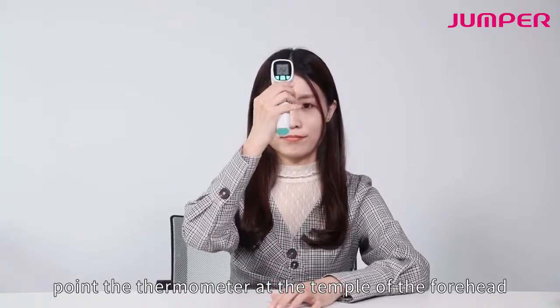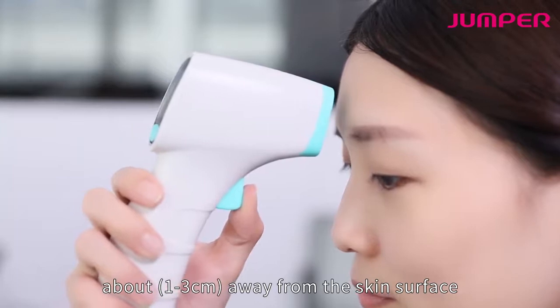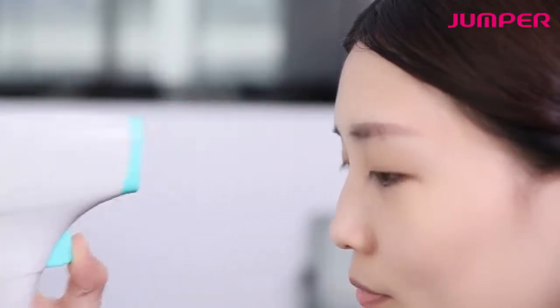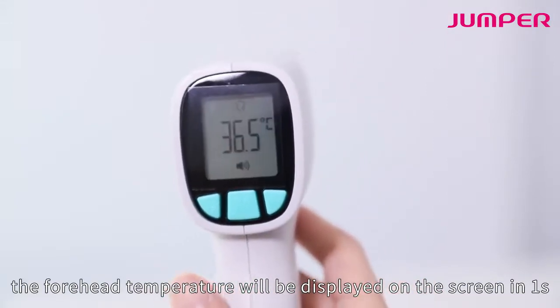Point the thermometer at the temple of the forehead, about one to three centimeters away from the skin surface. Press and release the measure button. The forehead temperature will be displayed on the screen in one second.